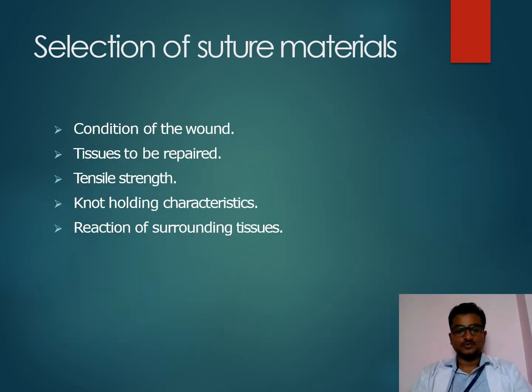Criteria for selection of a suture material: condition of the wound, tissue to be repaired, tensile strength, knot holding characteristic, reaction of the surrounding tissues.